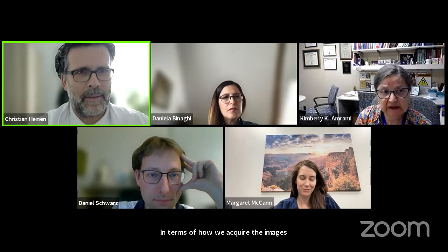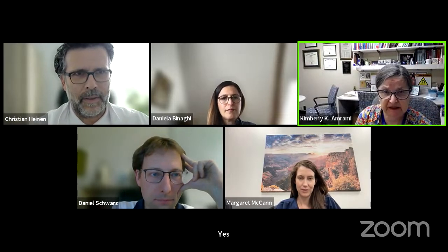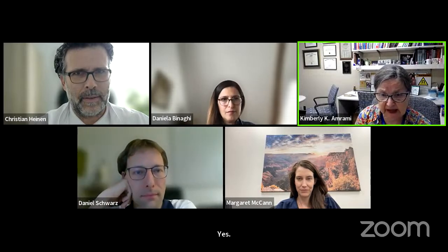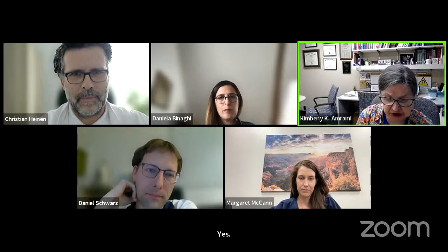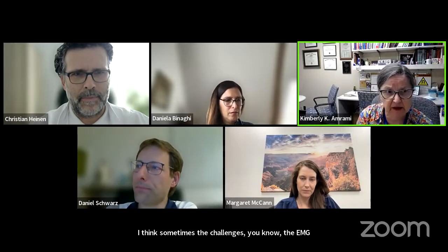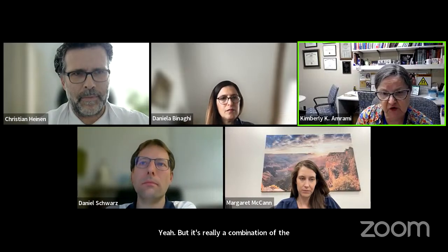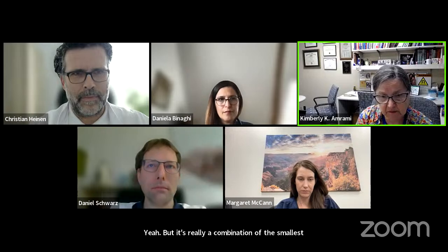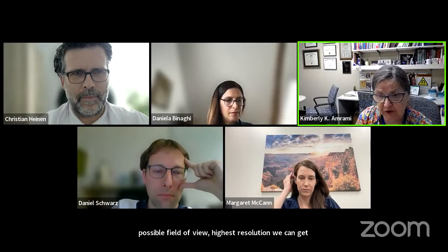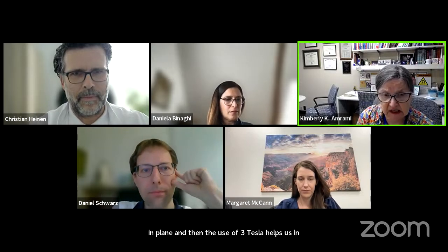Yes. I think we really have a focus on high resolution imaging, just the same as I know Donnie did in her practice. We absolutely tailor the exam for individual patients and the individual indication. Sometimes the challenge is that the EMG doesn't always localize it so well, and we might have to cover more area. But it's really a combination of the smallest possible field of view, the highest resolution we can get in plane, and then the use of 3 Tesla helps us in terms of getting the appropriate signal to noise.